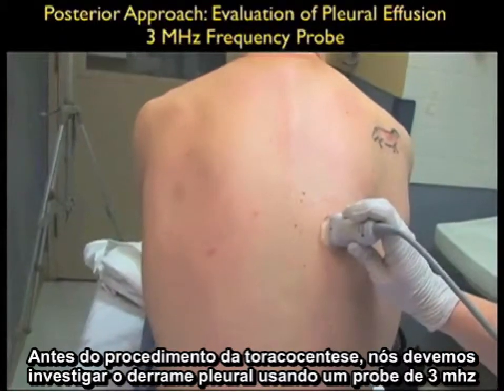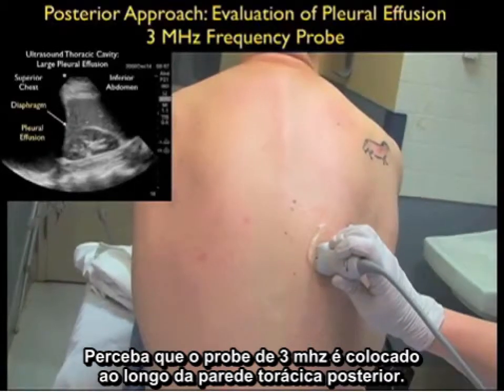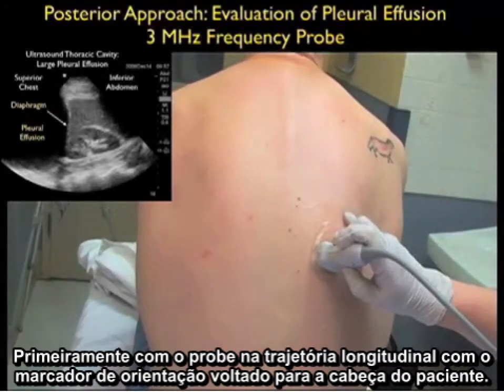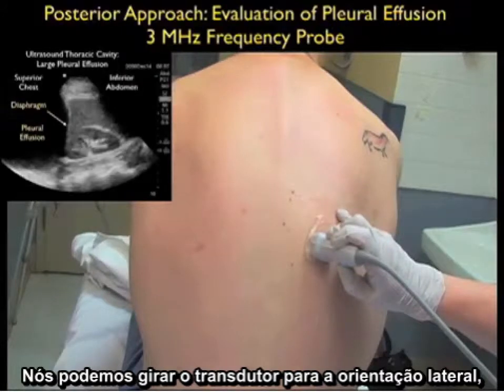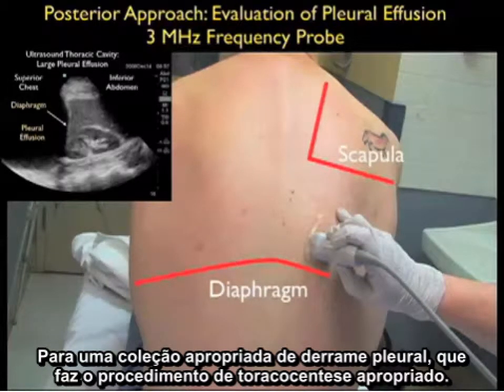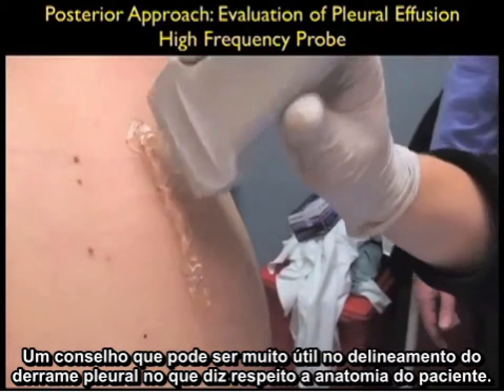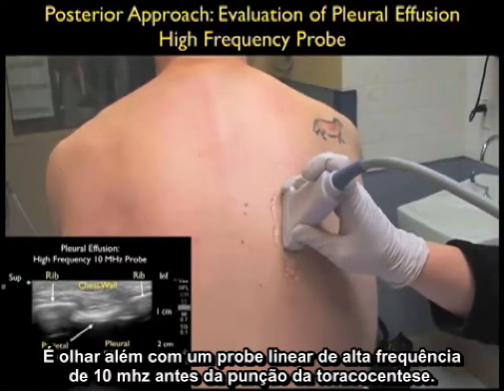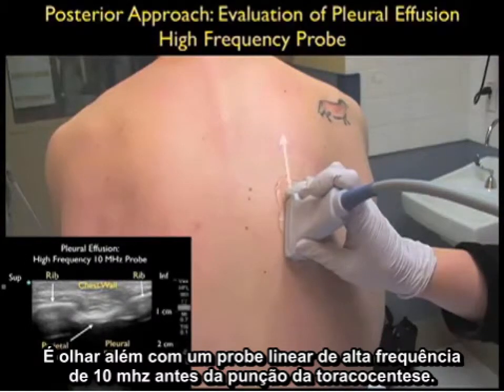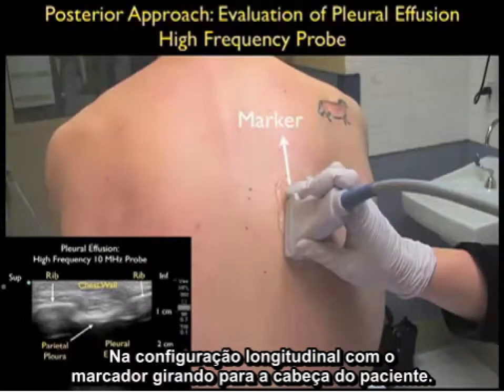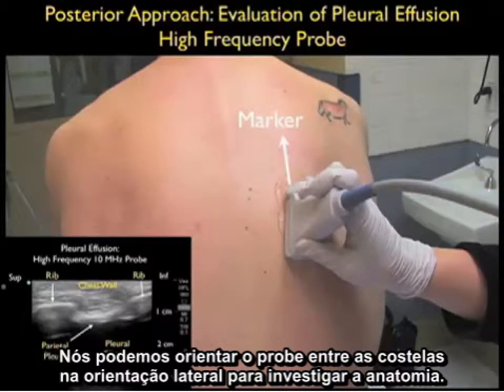Prior to the thoracentesis procedure, we'll investigate the pleural effusion using a three megahertz probe placed along the posterior chest wall, first with the probe marker in the long axis trajectory oriented towards the patient's head. We can then swivel the probe into the lateral orientation with the probe marker lateral to further investigate above the diaphragm for a suitable collection of pleural effusion. A clinically helpful technique is to further delineate the pleural effusion using a 10 megahertz high-frequency linear array probe, placed along the posterior chest wall in the long axis configuration or oriented in between the patient's ribs in the lateral orientation.